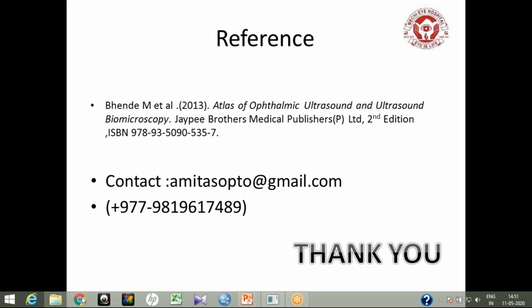Sir, he is asking, I think: can you just briefly explain how to perform the 30-degree B scan? Can you explain the procedure, please? Thank you, Priya. First we do the axial scan, axial and longitudinal scan, and then we have to tilt the probe 30 degrees.